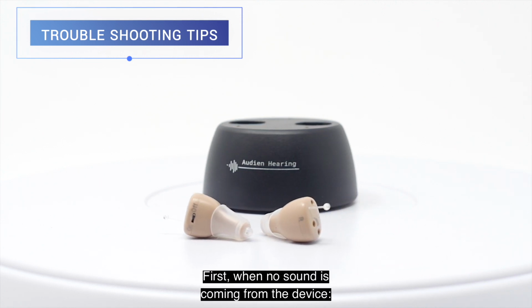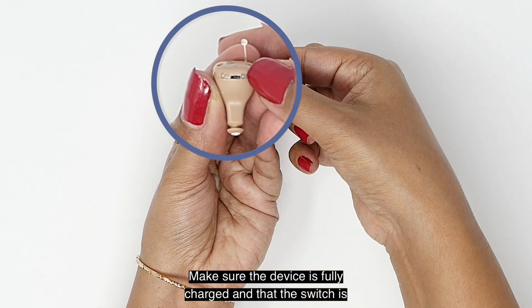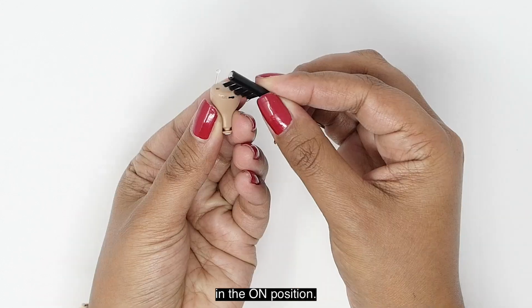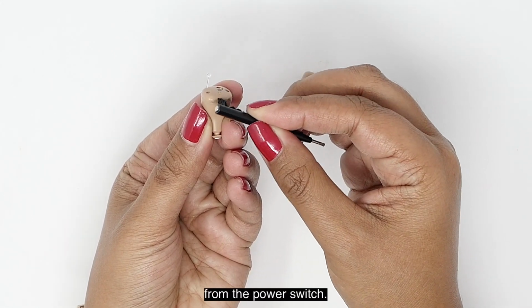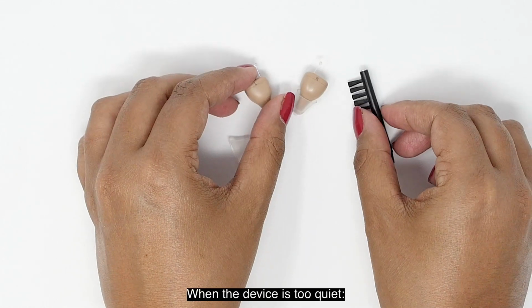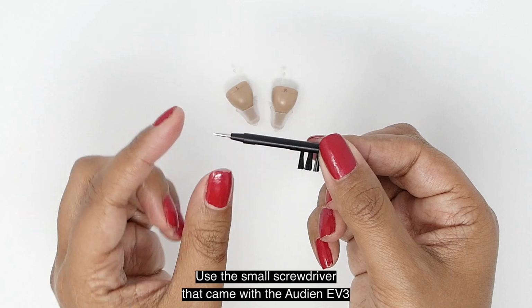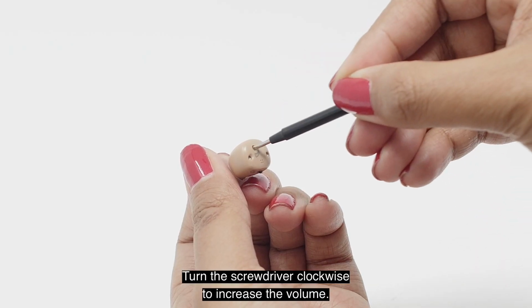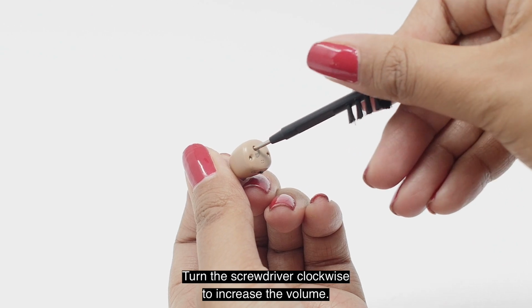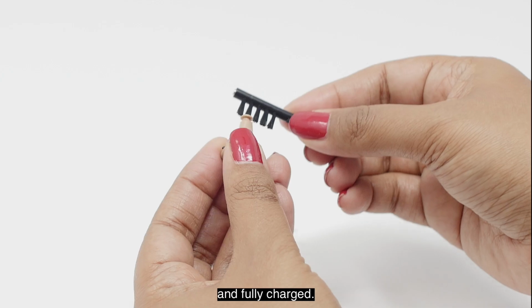First, when no sound is coming from the device, make sure the device is fully charged and that the switch is in the on position. You may need to clean or sweep away debris from the power switch. When the device is too quiet, use the small screwdriver that came with the Audien EV3 to turn up the overall volume. Turn the screwdriver clockwise to increase the volume. Also make sure your device is clean of debris and fully charged.